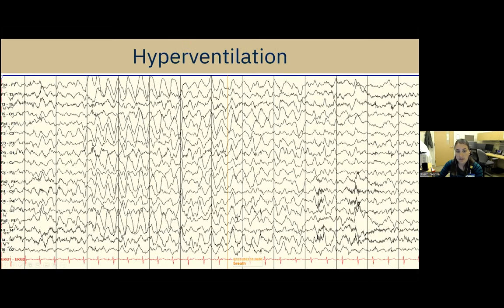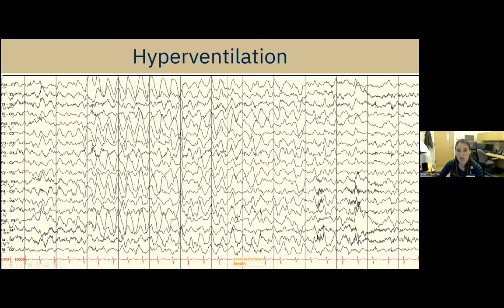The other thing we often do during an EEG is hyperventilation - for young kids, blowing on a pinwheel; for older kids, taking really deep breaths for about two minutes. This looks very different from the awake background - much slower, around three to four waves per second, which is delta wave slowing. But again, this is normal. Our brain slows down when hyperventilating, and importantly, it slows down the same amount everywhere, with no spikes or sharps - a normal response to the deep breathing exercise.